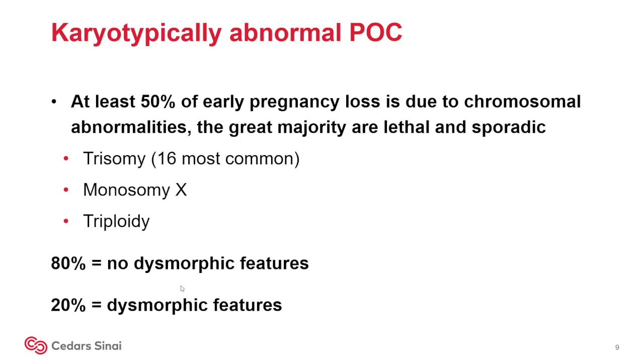Of course, if there was a karyotype done, for example, prenatally by chorionic villus sampling or amniocentesis, and I know this is a trisomy 13, for example, in my report, I'll usually say chorionic villi with dysmorphic features. But if I don't have cytogenetics in the case, I will refrain from making this call unless it's absolutely obvious. And some cases are absolutely obvious.